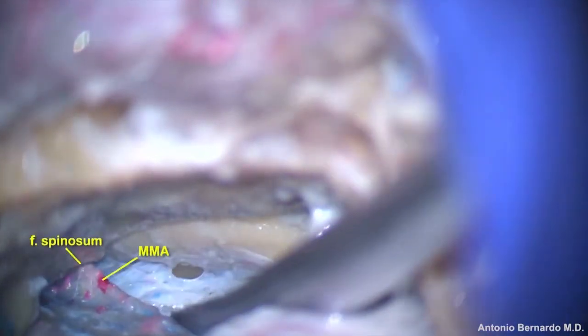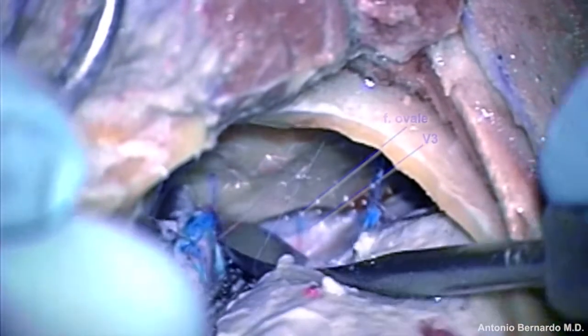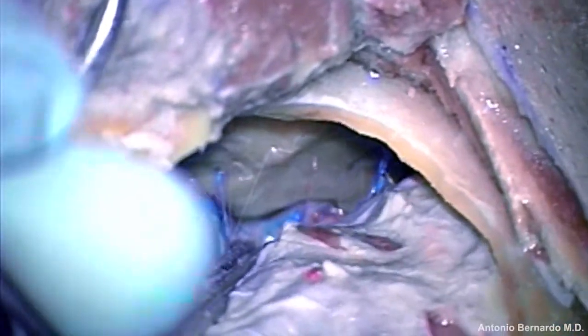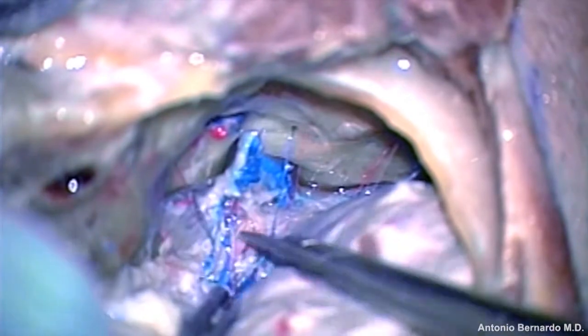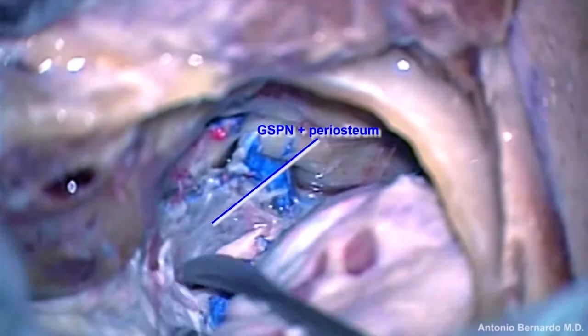The first target is to identify the middle meningeal artery and foramen spinosum, and V3 and foramen ovale. The middle meningeal artery is identified and cut, and interdural dissection is continued between the periosteum and the dura propria of the temporal lobe. The dissection continues anteriorly and posteriorly, leaving the periosteum on the floor of the middle fossa.